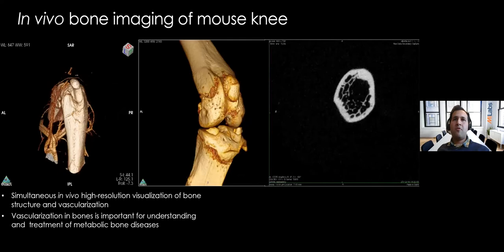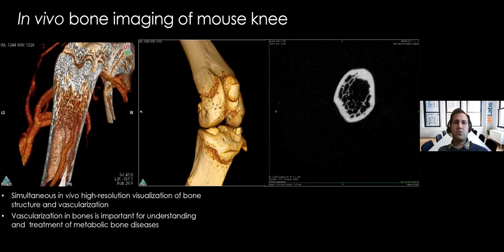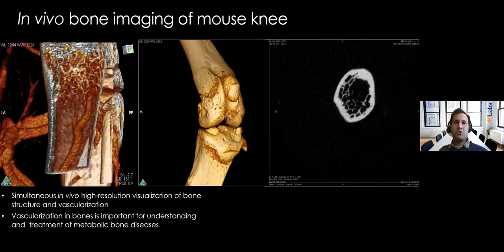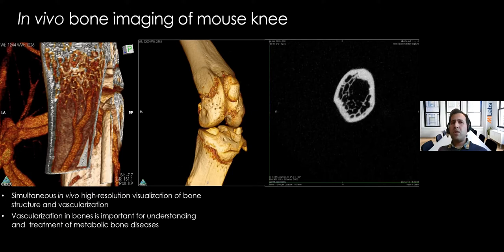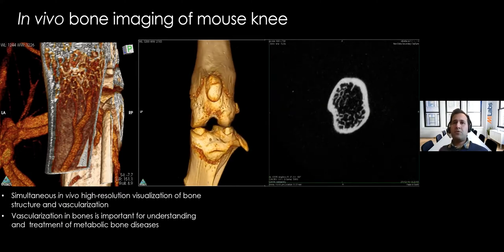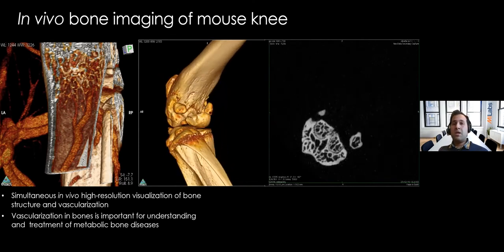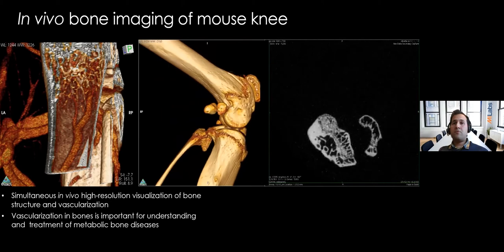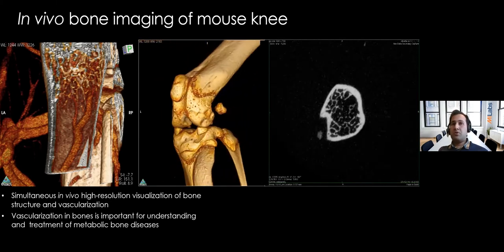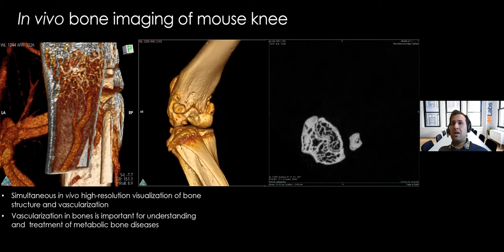This is another example of an in vivo application of mouse knee. The mouse was injected with a contrast agent, which allows us to see the vasculature of the bone very clearly. Vasculature is a very fundamental element of bone, helping it grow. In tissue engineering, vascularization is also one of the very important parameters. Here we can see the vessels very well, and we can also see the trabecular structure in the mouse knee. Although it's quite a small joint, we are still able to see tiny structures very well, as well as the cortical bone.